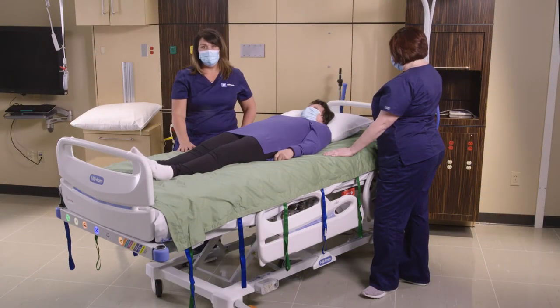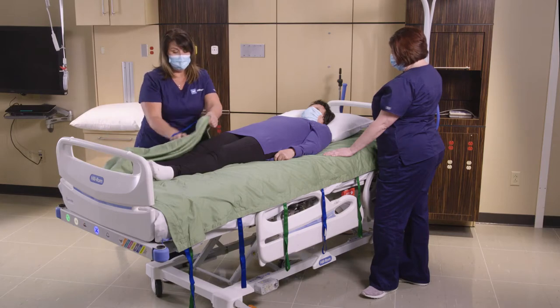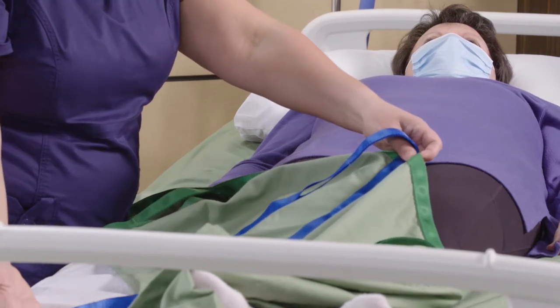Now we're going to show you how to use the repositioning sheet to boost and turn your patient. The repositioning sheet is already on the bed. The repositioning sheet has straps that go on the underside, and it's important that these straps face away from the patient.